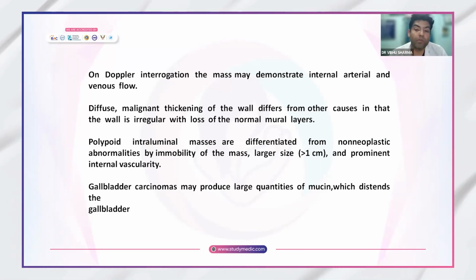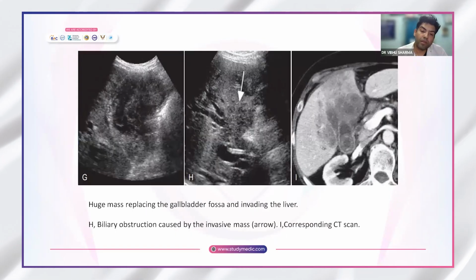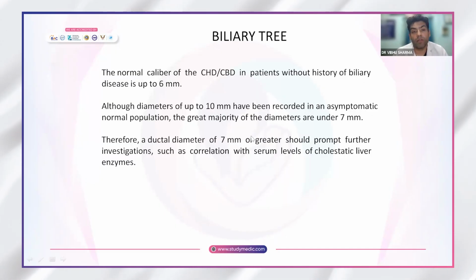If the gallbladder is abnormally distended, again, you should suspect GB carcinoma. This is the case. You can see a big lesion within the GB wall. Here again, a polypoidal lesion, and you can see malignant thickening of the wall. So, a case of malignant GB carcinoma. Again, you can see that this has spread now. There is infiltration associated with the thickening. So here, you can't see the margins of the liver and GB separately. So this is a case of GB carcinoma.